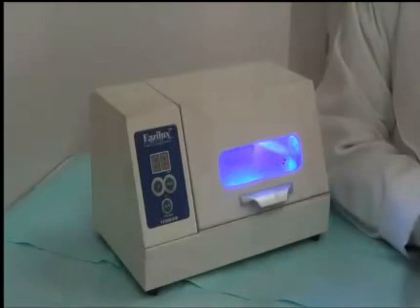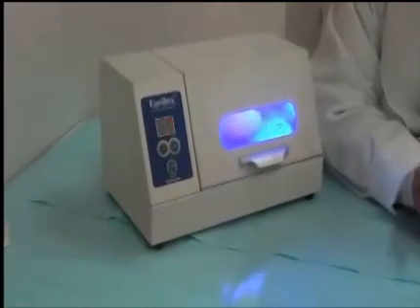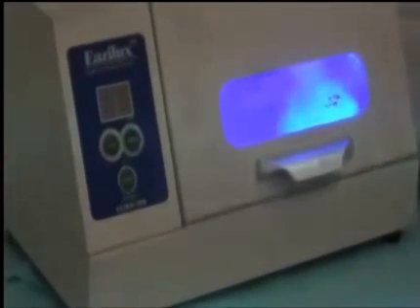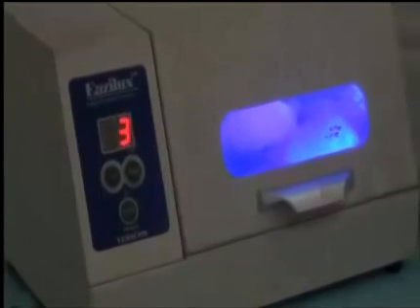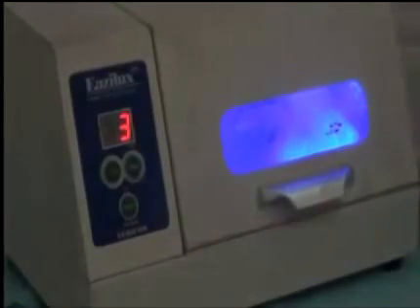This will expose more parts of the tray to the light all around. But even with this rotation, sometimes parts of the tray do not become solid, meaning after the first light curing cycle we take the tray out from the cast and expose the fitting surface of the tray to the light as well.